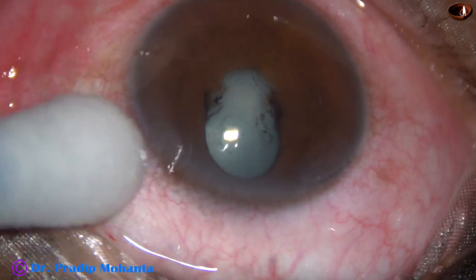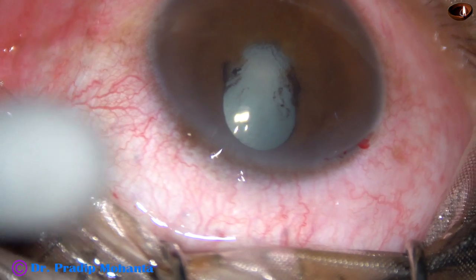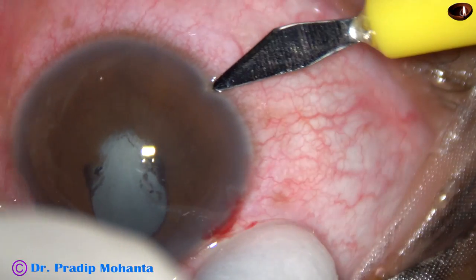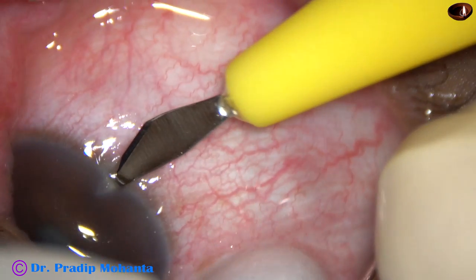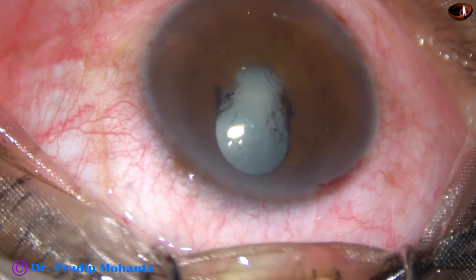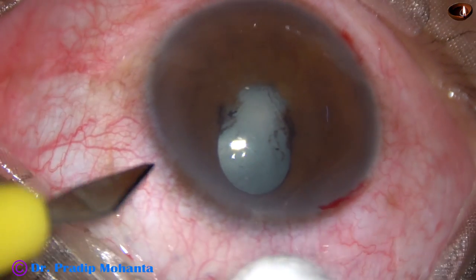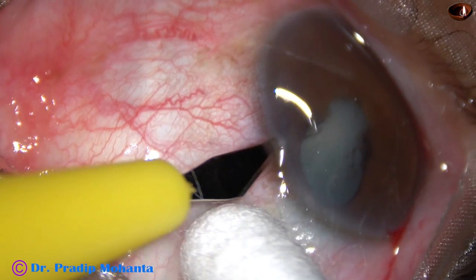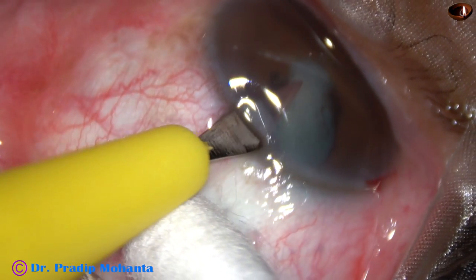I have made the main incision at the posterior aspect of the limbus at 10:30 o'clock. There is a side port at 8 o'clock and another side port at around 2 o'clock.